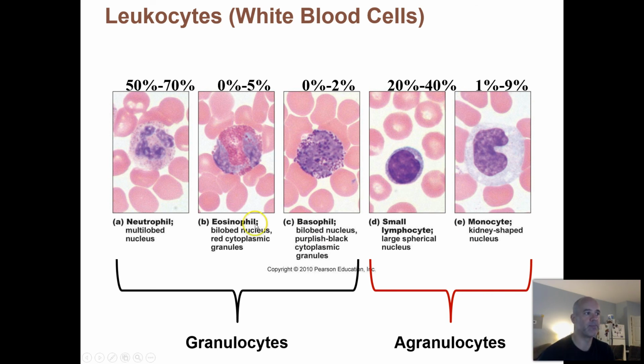indicates a basophil. All right, what about your agranulocytes? How would you know if you were looking at an agranulocyte? You don't see obvious spots in the cytoplasm. With the right stain, the cytoplasm usually has a sky blue color to it.